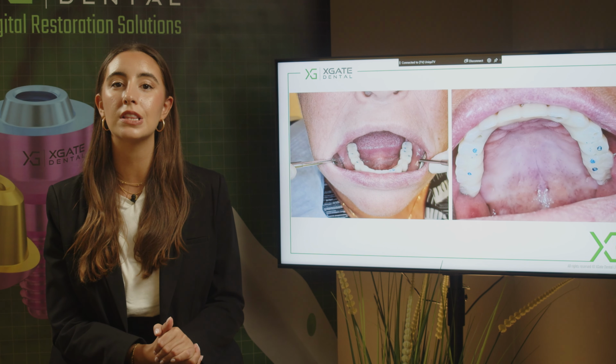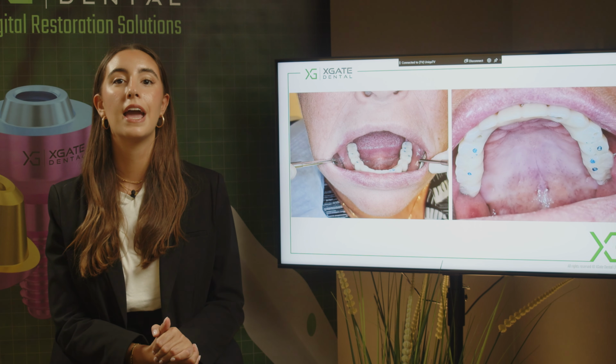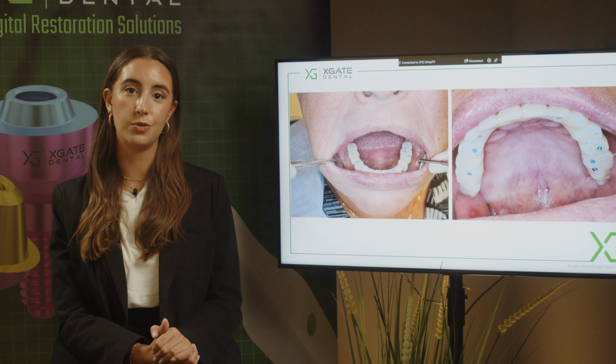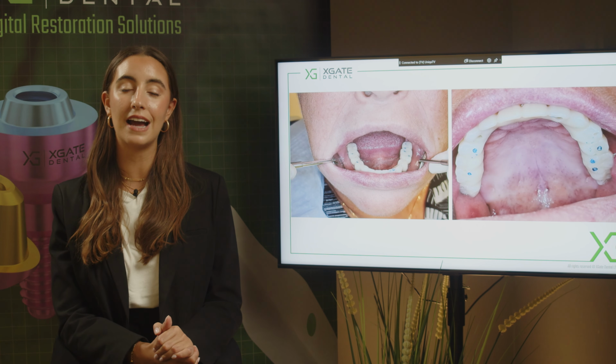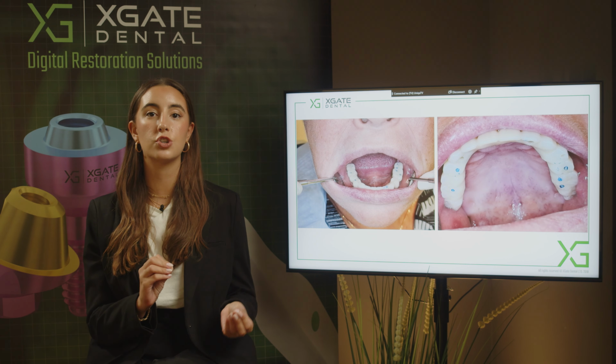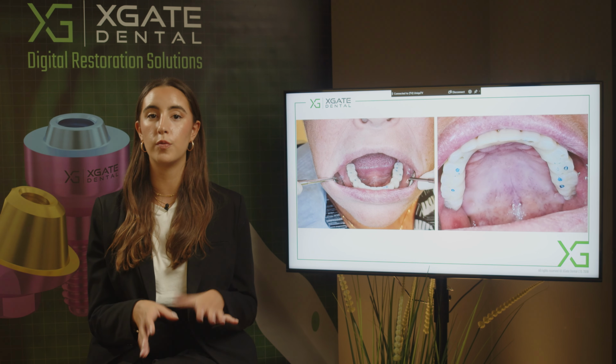Maybe you can achieve it a little bit better. She closes and both sides are in occlusion. You need to correct a little bit on the occlusion. We got a central line in exactly the same place that we wanted. We have the anatomy of the teeth that's good enough for us, and we can add or remove material.